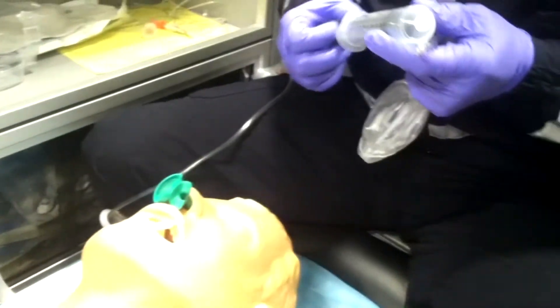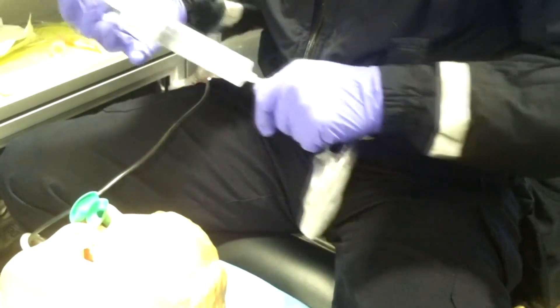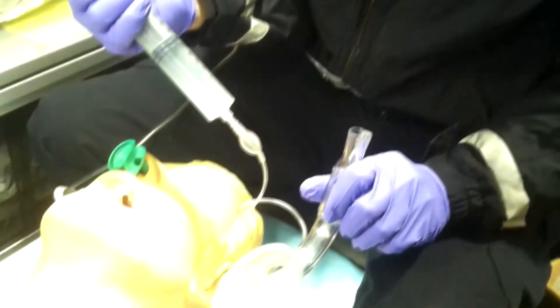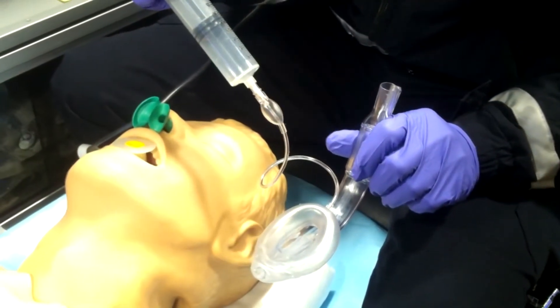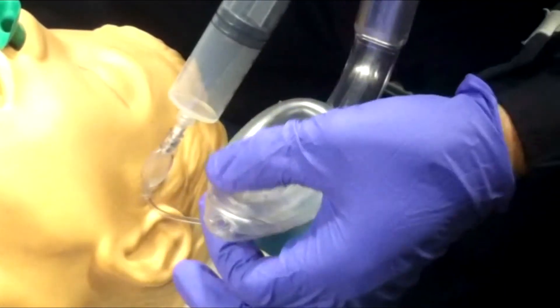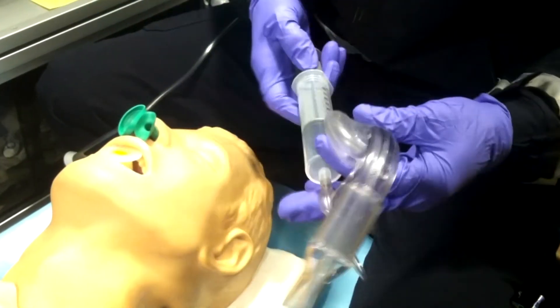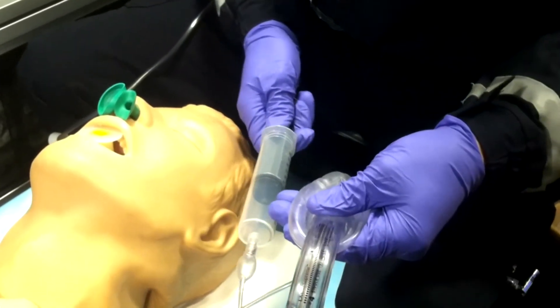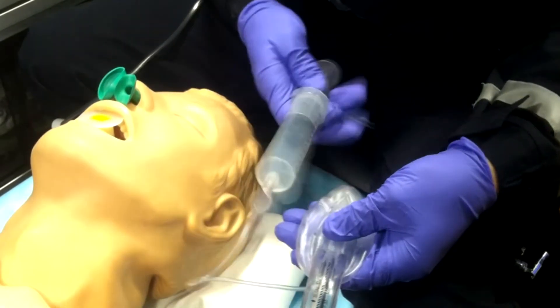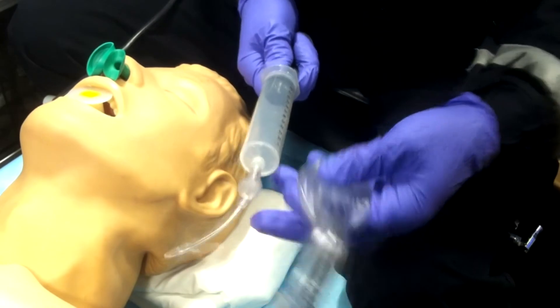Get out your LMA Supreme and make sure it's appropriately sized — for adults it will be around a size 3 or 4, most likely a 4. It comes pre-inflated, but I want you to inflate it yourself first to check for any breaks, tears, or leaks. Inflate it, feel the cuff, look for damage, then deflate it. Squeeze it down to give it a nice flat profile and anatomically correct positioning for placement into the airway.